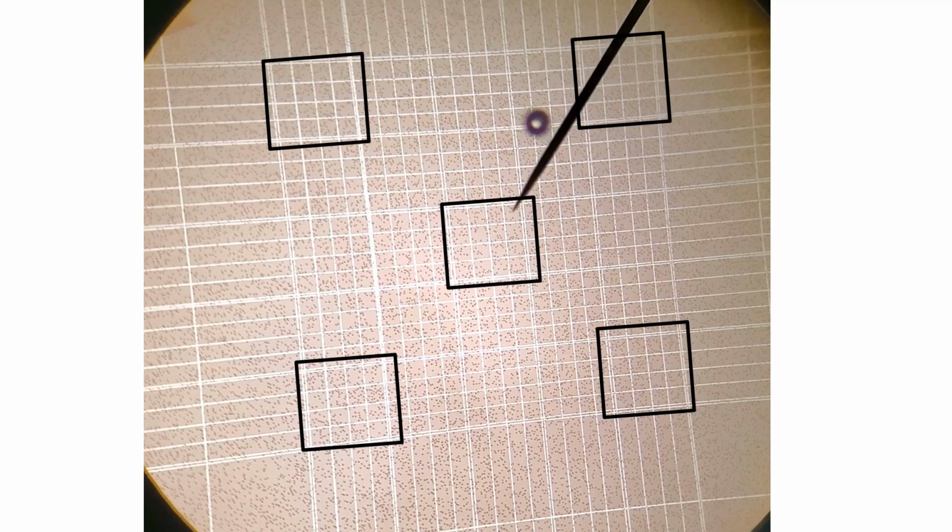So instead we do a sampling procedure where we say, well, if we assume that the red blood cells are spread pretty evenly across the entire slide, then we can just sample some parts of the slide and then extrapolate the total red blood cell count from the areas that we sampled. So traditionally on a hemocytometer, the areas that are picked are shown in the black boxes.